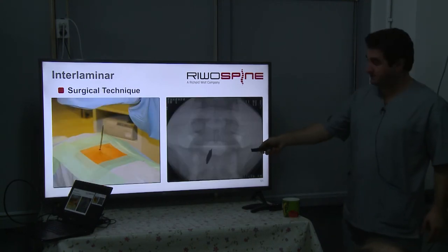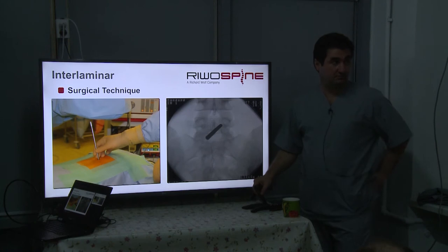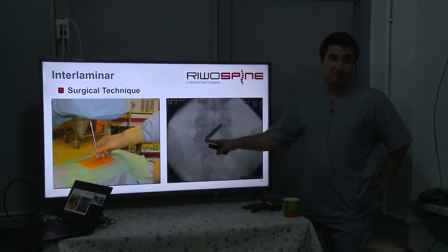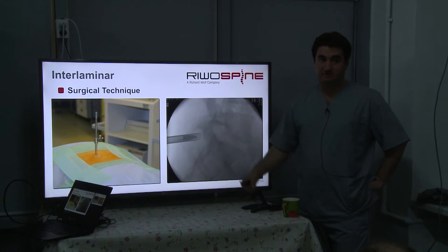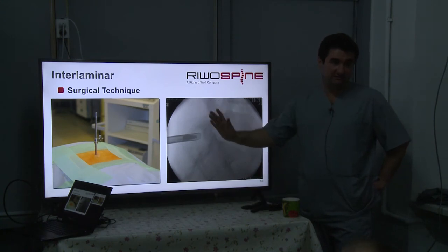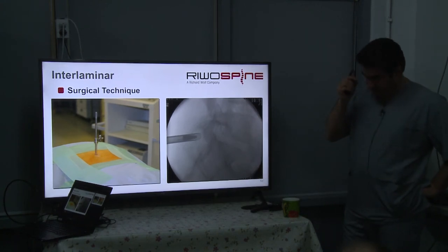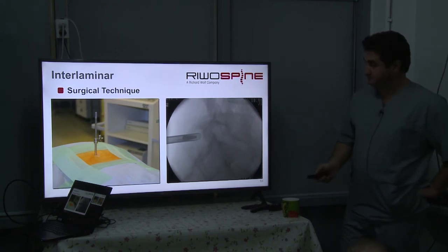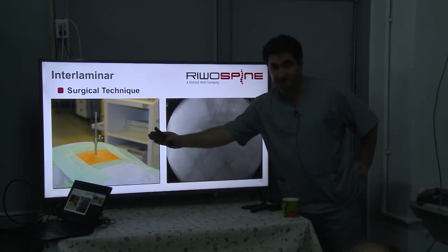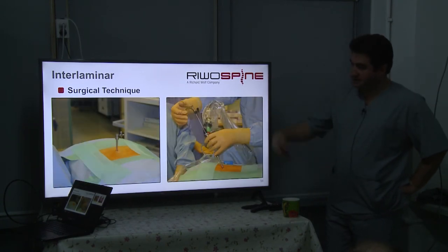And the next we do incision and directly dilator. And then we prefer to put the dilator on the bone. And then we switch to lateral position. You need to check the position of the dilator here. It's outside. Then we introduce the working sleeve after that. Always the working sleeve's opening is looking through the medial aspect now. Then we start with the endoscope.